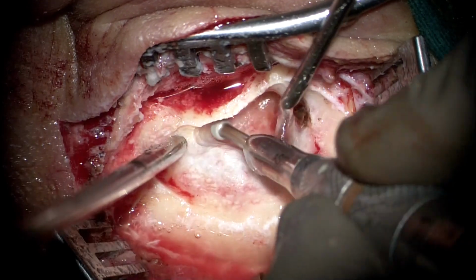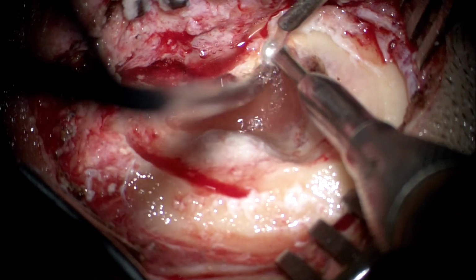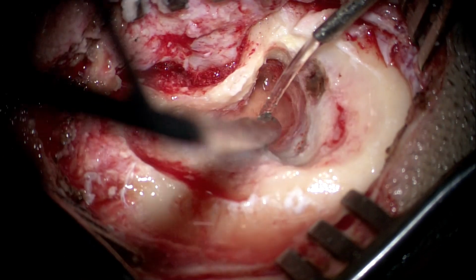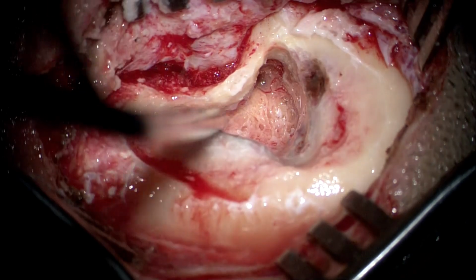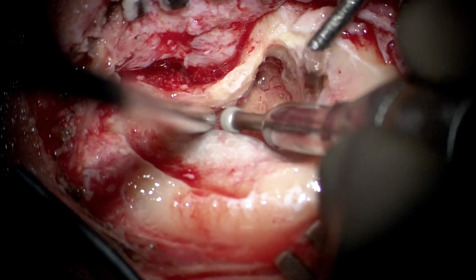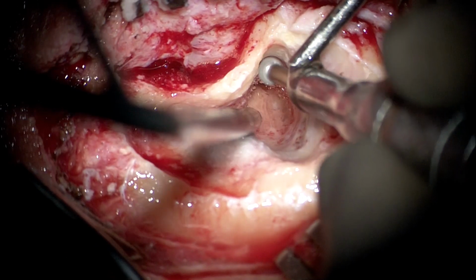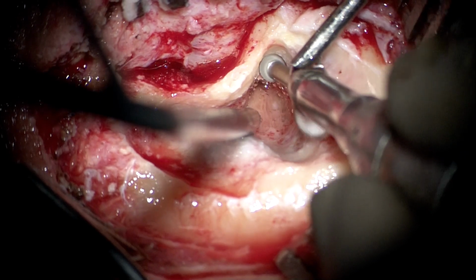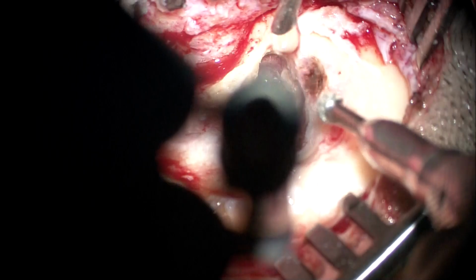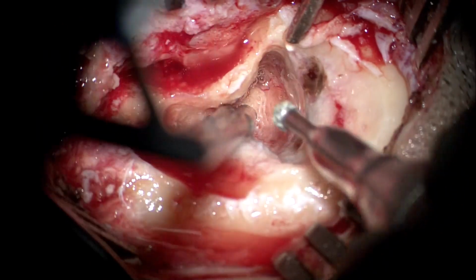The burr also must not be kept stationary at one time, because then that has the potential to go through. The burr must be constantly moving, and on any exposure of the dura of the sinus, one must stop immediately. The posterior canal wall is still thick and needs to be thinned further, although making it paper thin should be avoided, because that in long term can lead to resorption of certain portion of the posterior canal wall, hence causing possibilities of eventual retractions.